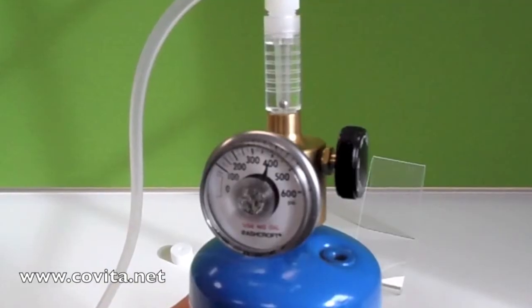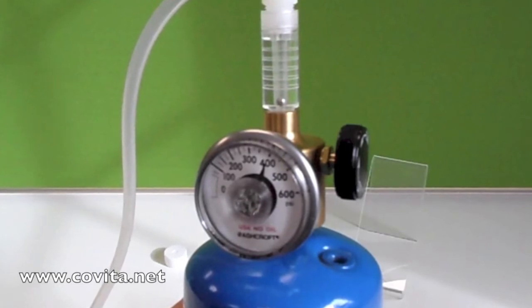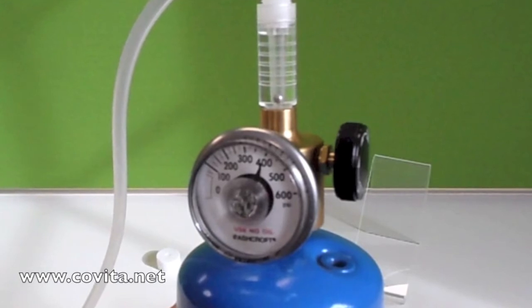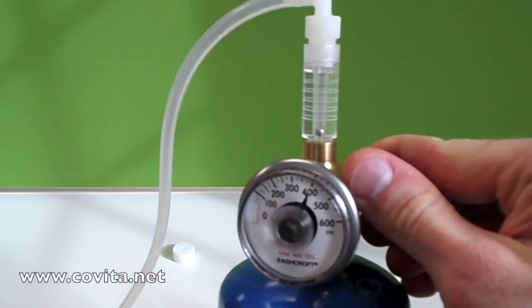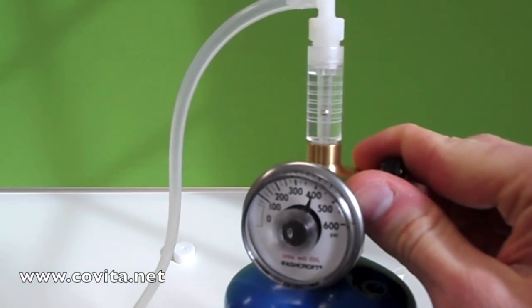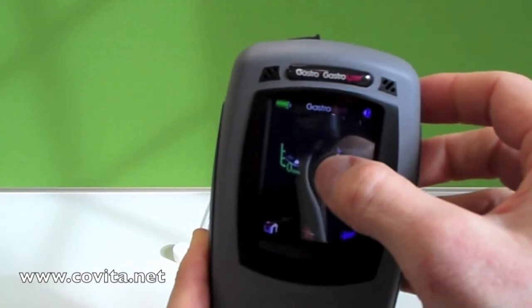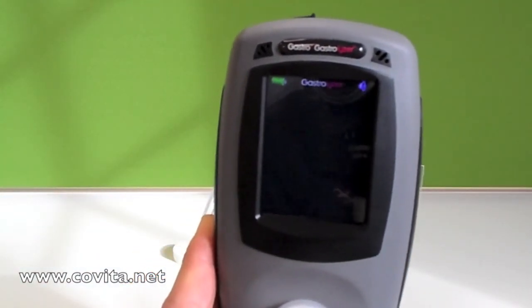Now we are going to turn on the gas by turning slowly counterclockwise. It is important to do this gently with precision, because slow adjustments in either direction will cause a shift in the ball. We want to balance the ball between the second and third lines. Immediately after adjusting the flow rate to 0.5 L per minute, touch the calibration icon on the screen.